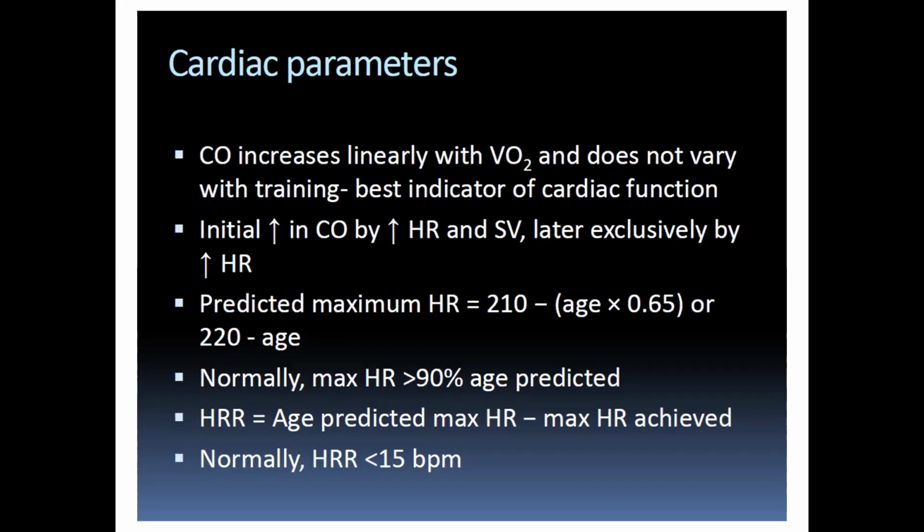So if you're measuring it at anaerobic threshold, you have to hit the anaerobic threshold. Yes, you have to be very sure, at least in the vicinity. You should be very close to where it is, right?